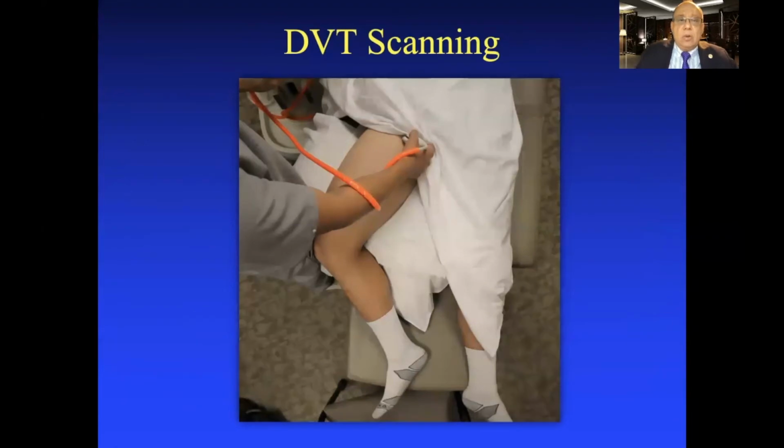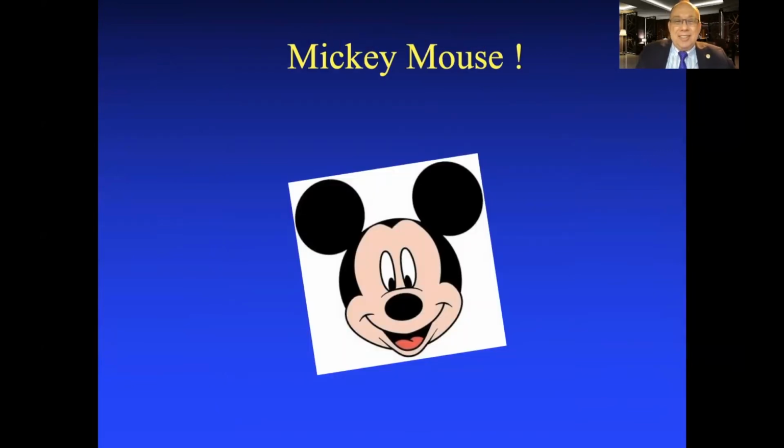The patient can lay down. And notice the rotation here of the thigh with the flexion here of the calf. This is to better access the anatomical regions that we want to study. So the patient can be in supine position. Different from the venous studies for the valvular system, where the patient needs to maintain the standing position. And here, that's the way we start our studies.